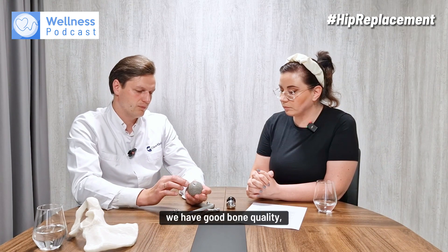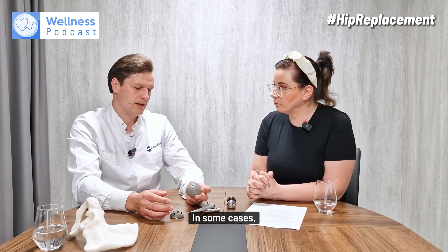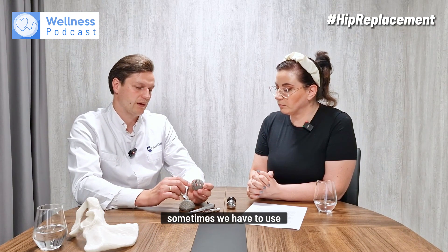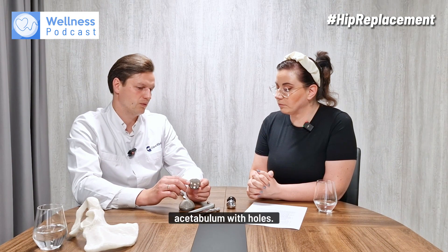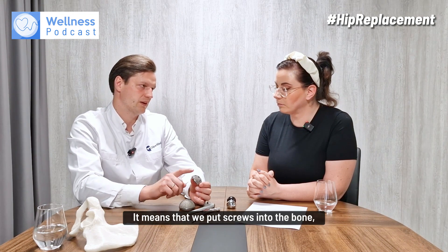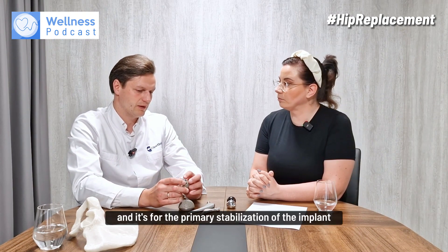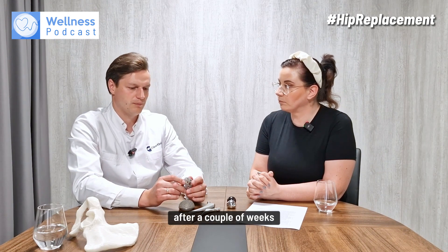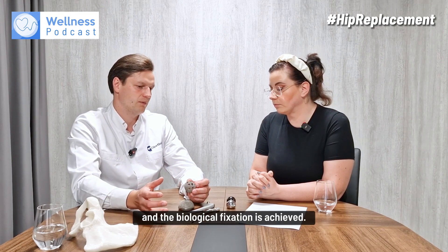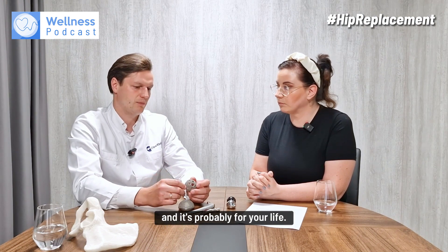If we achieve good bone quality and good fixation, we do not need any additional screws. In some cases — revision cases, post-traumatic cases, or avascular necrosis — when we have softer bone, we sometimes use an acetabular cup with holes for additional screw fixation, just to keep the implant in place for primary mechanical stabilization. After a couple of weeks, the bone starts growing into or onto the implant, and biological fixation is achieved — it's bonded with your bone, probably for life.